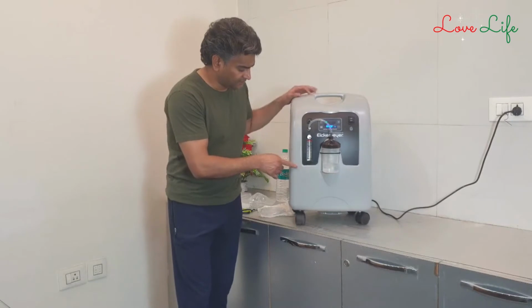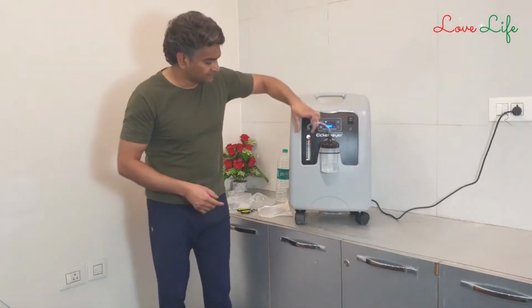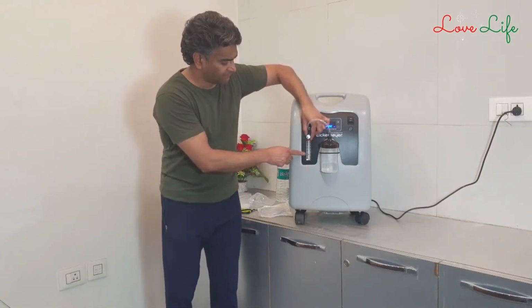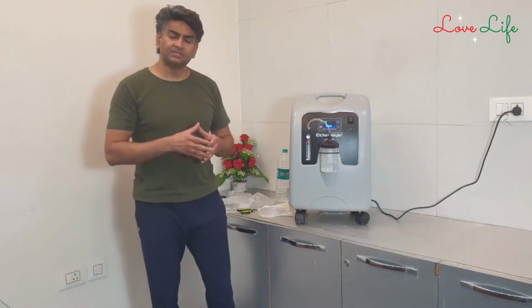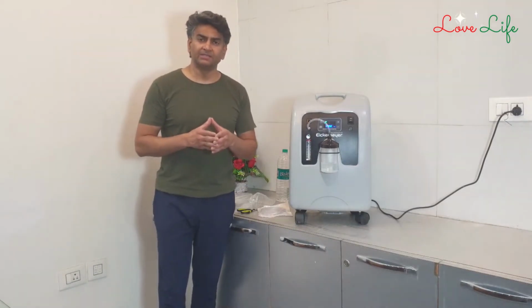Here we see LPM. LPM stands for liter per minute. You can go up and down from here. So this is at 1 liter. You can go up. This is 5 liter. In this machine, the concentration of oxygen remains minimum 93%.